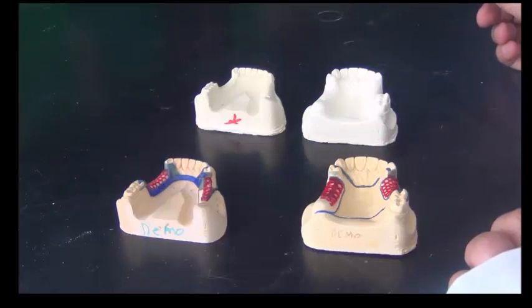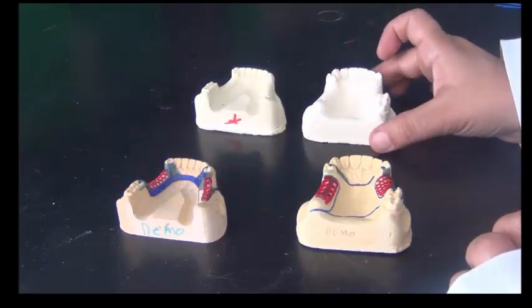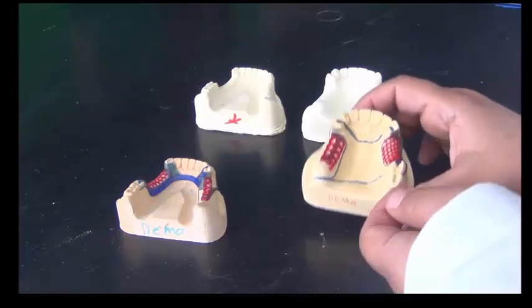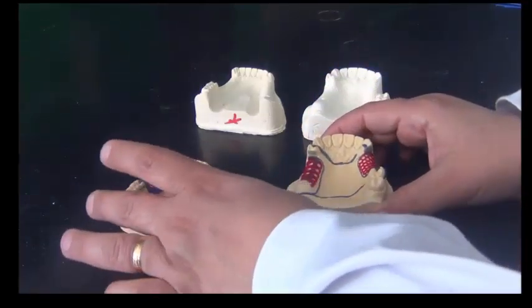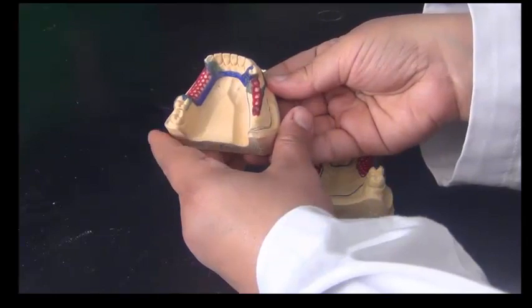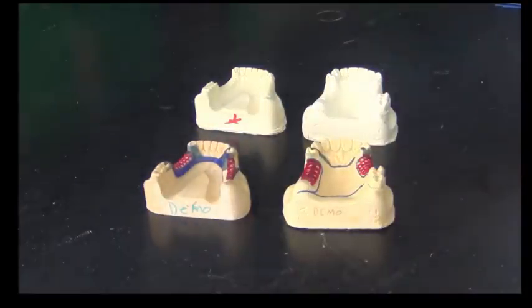Before doing the casting process, we have to design the metal framework that we're going to utilize. This design is done by wax. On the same cast, we begin adding wax components that will represent the metal framework. Whatever I'm adding to this cast will actually be the metal framework later on. We're going to add these waxes in multiple components and multiple layers, and because they have different purposes, names and structures, we're going to demonstrate them step by step and let you do the step in between after each instruction. So now we're ready to begin our work.